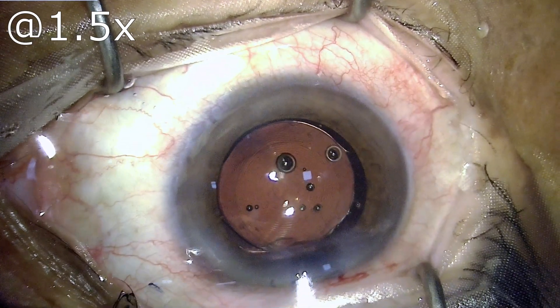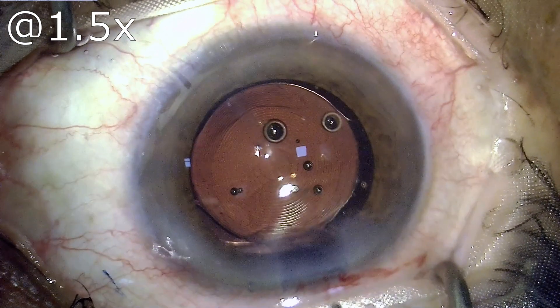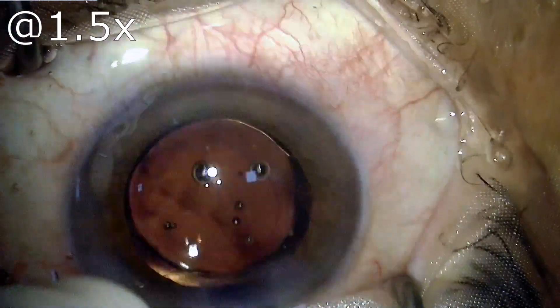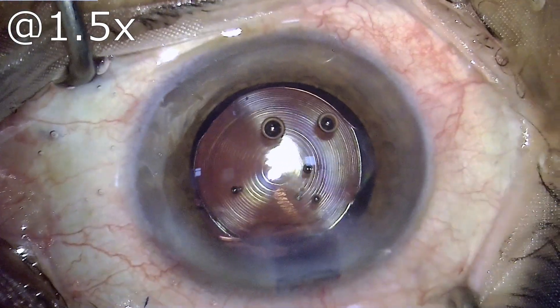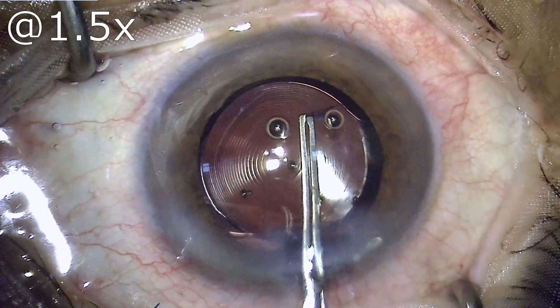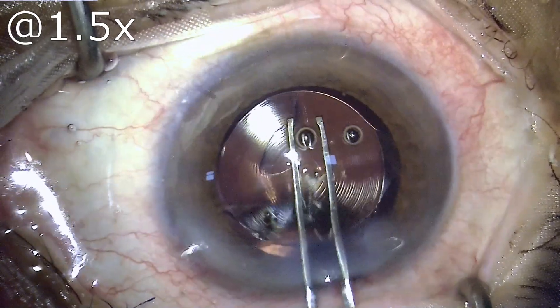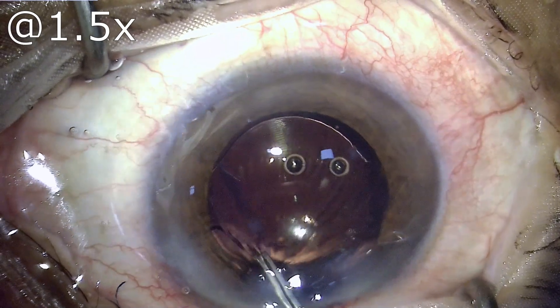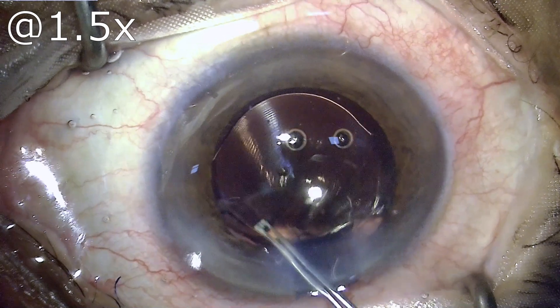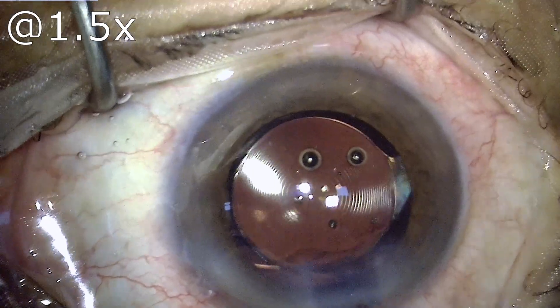Proceeding to enlarge my capsulorhexis, which can be done at this moment not only safely but also with the sizing of the capsulorhexis guided by the size of the IOL optic. The stained capsule which is visible to us has been nicked at one point, and using that nick I have extended the capsulorhexis.